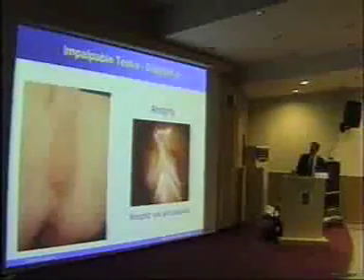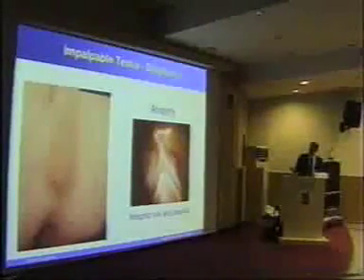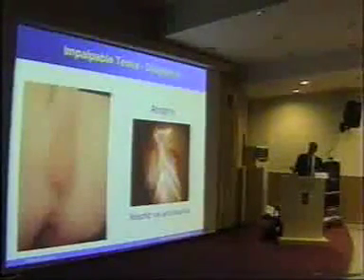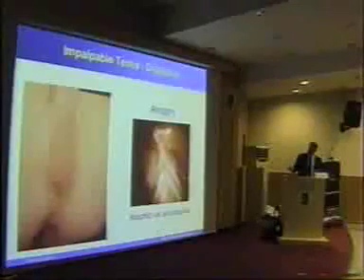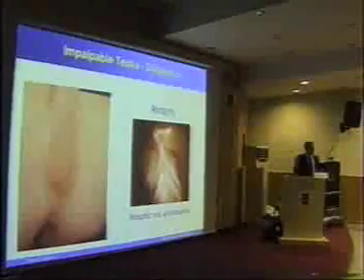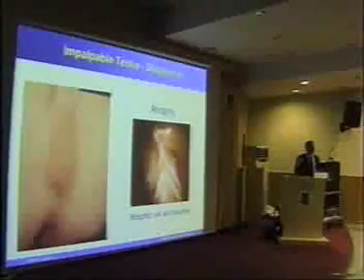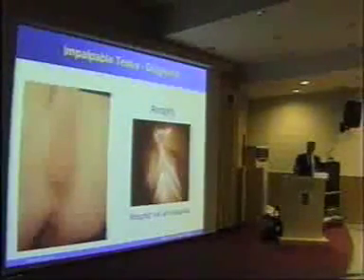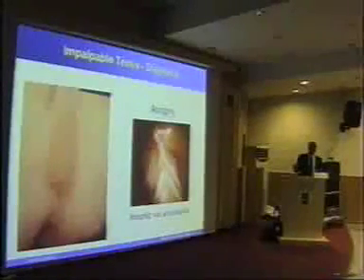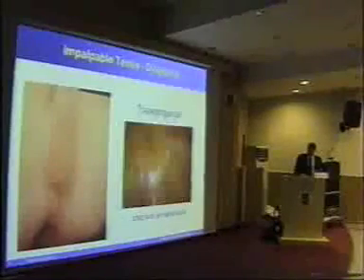Or you might see an atrophic testicle where the vas, this is on the right side, and the vessels here are atrophic. Unfortunately, I've not got the other side to compare with. This is the internal ring, and they're going through the internal ring, so the inference from here is that there has been a distal problem, maybe an in utero torsion within the inguinal canal leading to impalpability, and this atrophic vas and vessels is diagnostic of that.